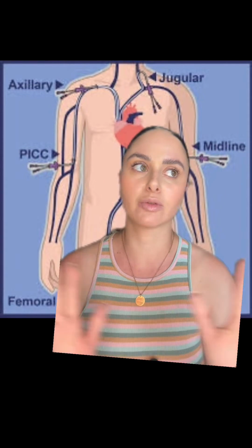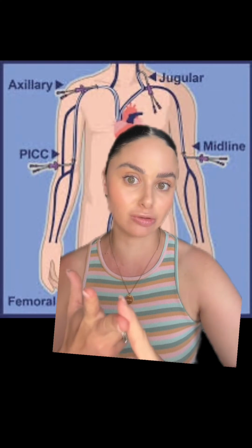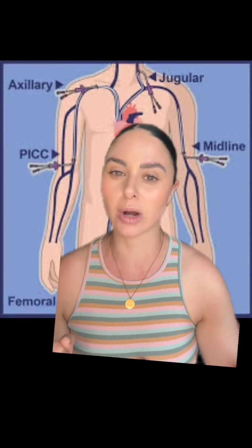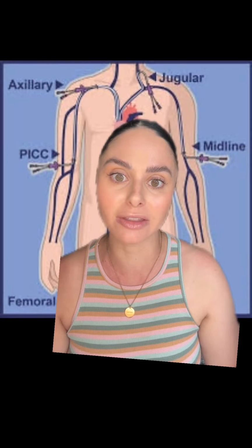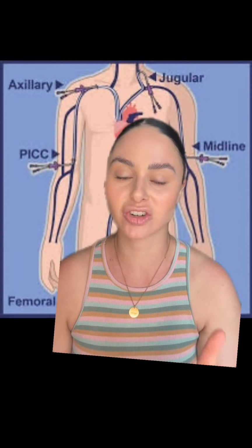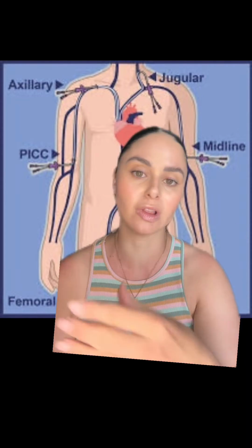Before we go ahead and even remove a central line, we need to make sure that we have an order from a provider and that it's safe to do so. We need to check the patient's coagulation factors to make sure we don't have a super elevated INR, super low platelets, or they aren't on any extreme blood thinners. Like if they had just gotten TPA, you're not going to remove a central line. We also want to make sure that the patient isn't currently running any medications through the central line that can't be moved to another line elsewhere.